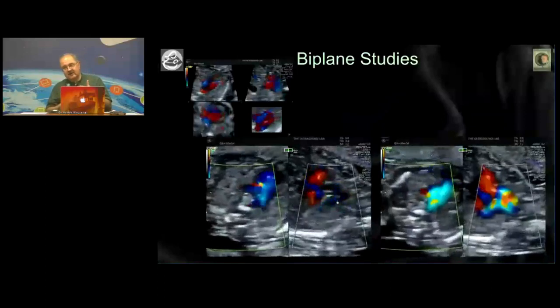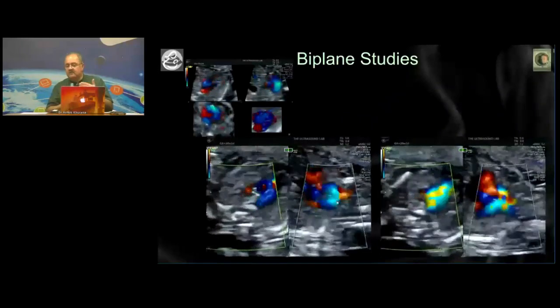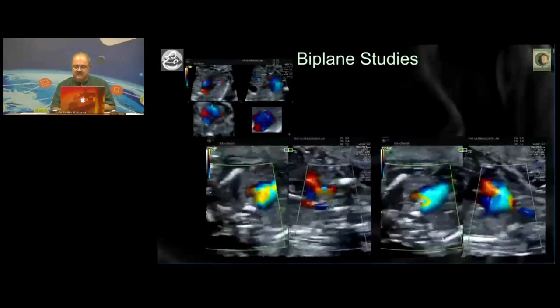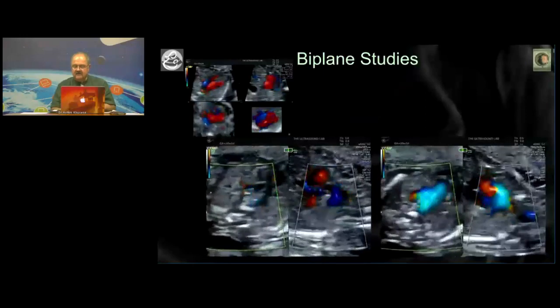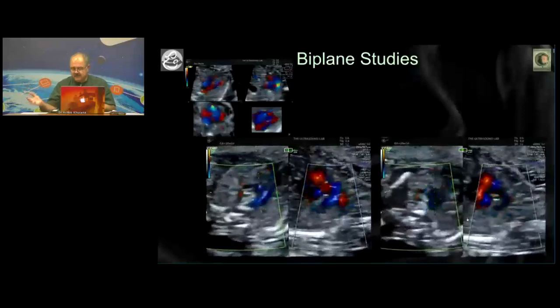And this happens with the electronic 3D transducer, and it works fantastically. It has good sensitivity, and you can see the three vessel view on one side. I have something I can focus on here. If I take it into the pulmonary artery, I will get a pulmonary arch. If I take it into the aorta, I will get the aortic arch, and therefore my job becomes much simpler.